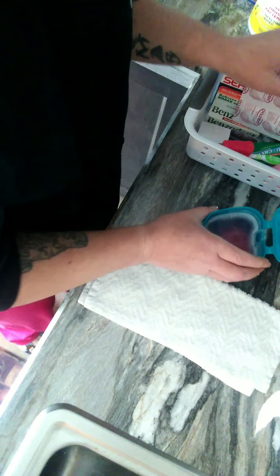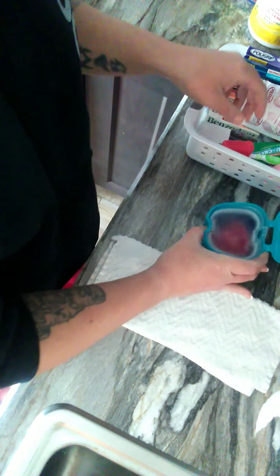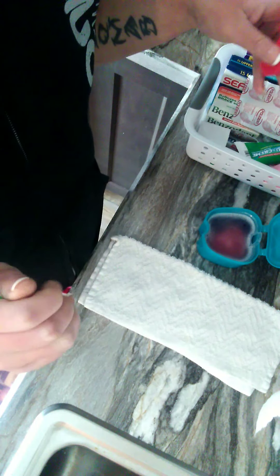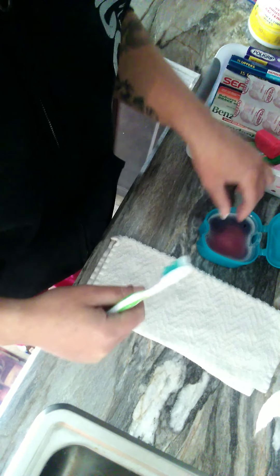What I do is I let this sit and soak for about 20 minutes to half an hour, sometimes longer. If you do have metal part dentures, do not in any way leave it longer than what it says — it can tarnish.